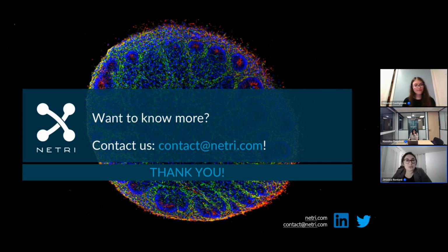Yes, thank you for this question. So just to remind, Matrigel is a hydrogel that is an equivalent of extracellular matrix and serves as a 3D scaffold for the organoids. But there are some animal compounds and it's not well defined, with some variation from batch to batch. So it's not really compatible for preclinical application. For these reasons, we follow a protocol in which there is no need of Matrigel.